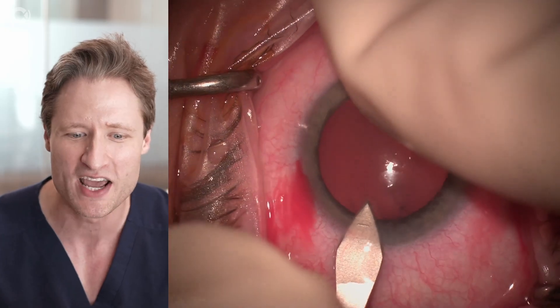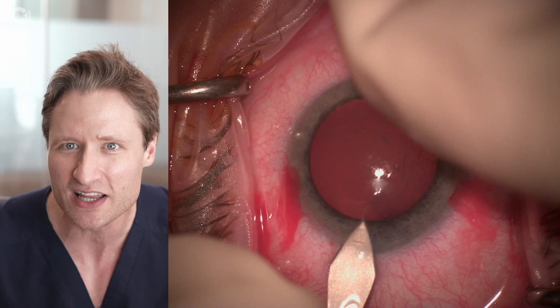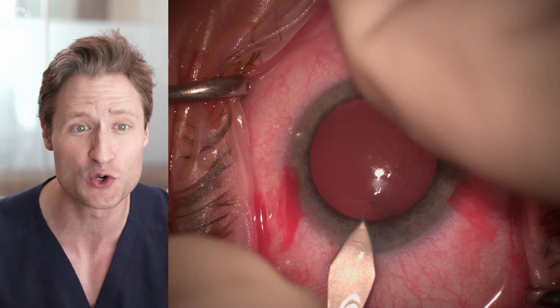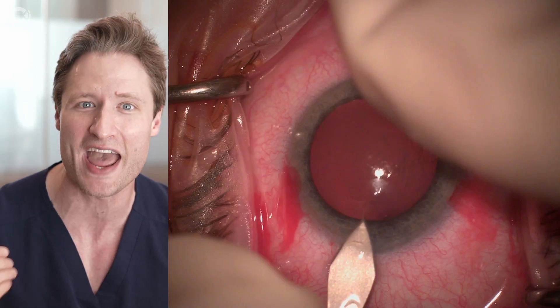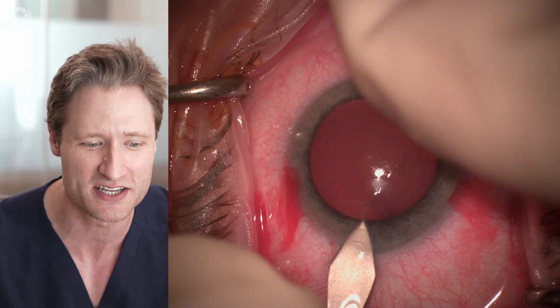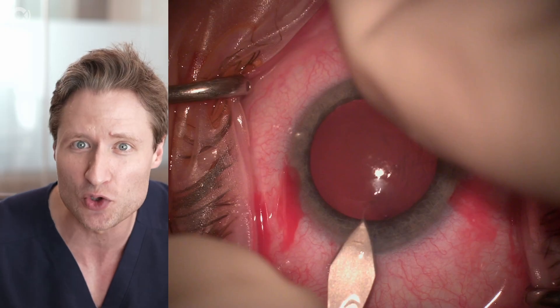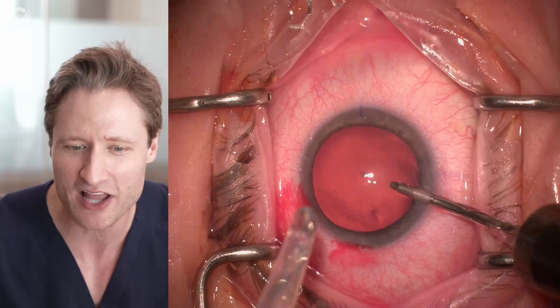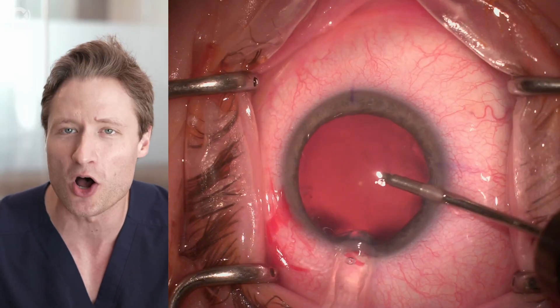When you have a wound that's too long, the lens ends up getting trapped in the wound. The second problem is the wound is also too wide — I expanded it, so even though it's a three-millimeter keratome, the wound is probably 3.25 to 3.5 millimeters wide. I thought a big wound would make it easier to get the lens in, but it turns out that too long and too wide causes serious problems.